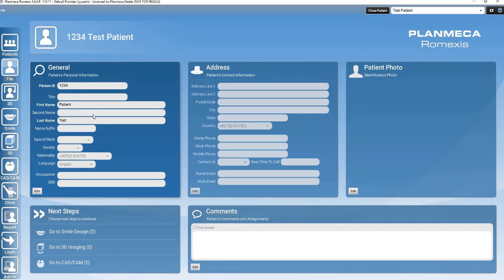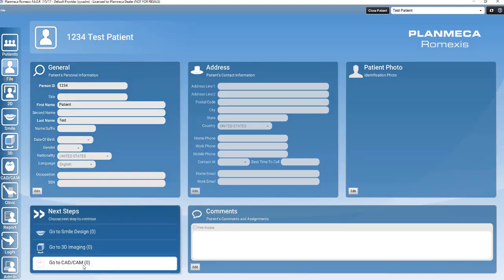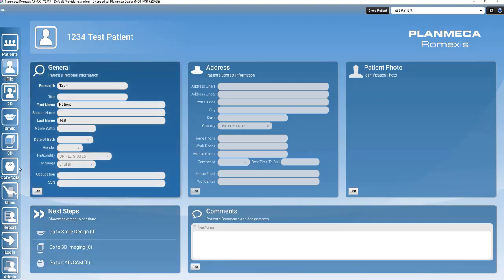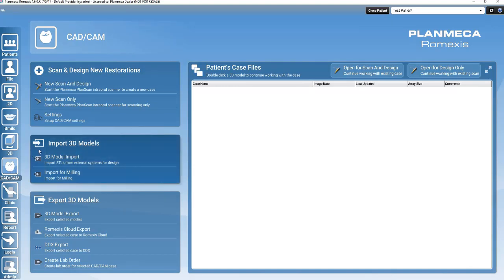You may access the CAD-CAM module by clicking Go to CAD-CAM under the Next Steps window or simply clicking on the CAD-CAM module icon on the left-hand side of the screen. In the patient's file, there is a box on the left-hand side called Import 3D Models.